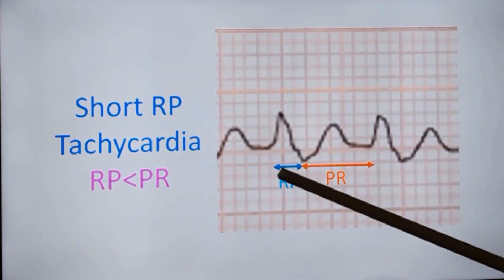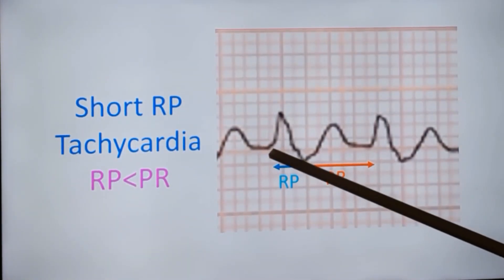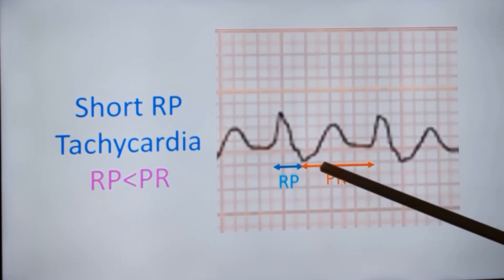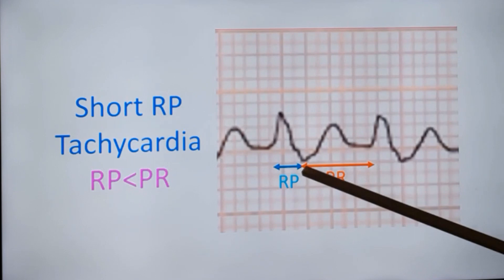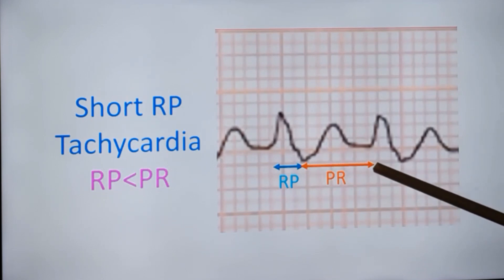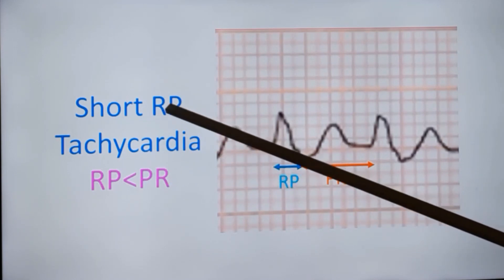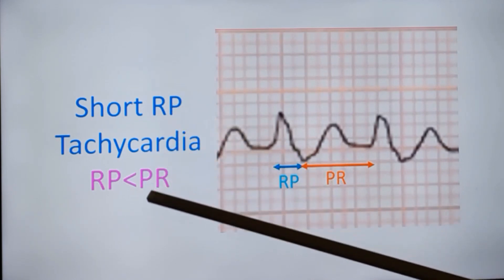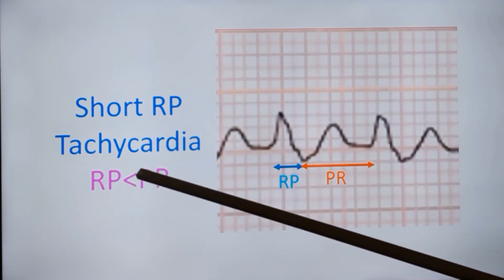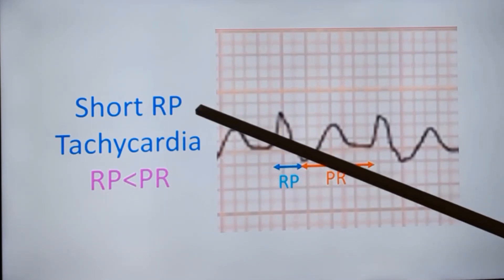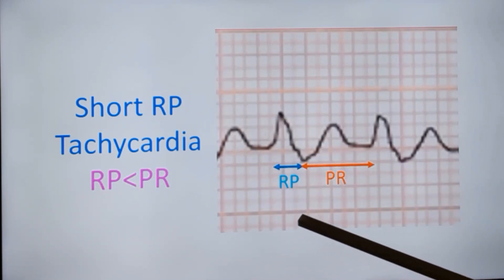You can measure the RP interval from the onset of the R wave to the onset of the retrograde P-wave, and the PR interval from the onset of the retrograde P-wave to the subsequent R wave. In this ECG you can see that RP is short and RP is less than the PR interval. This is known as a short RP tachycardia.